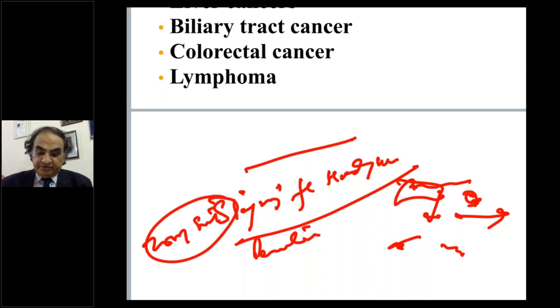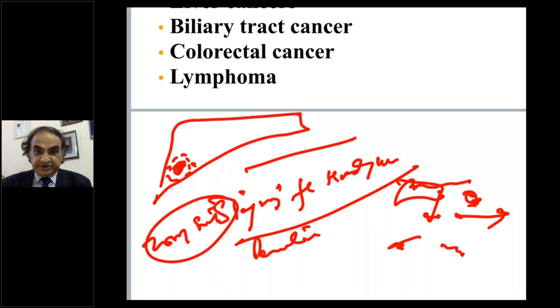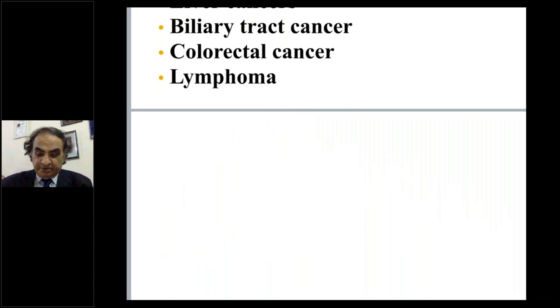In colorectal cancer, take care of where the metastasis is, record it, use cold scissors, remove it, fulgurate it later. Don't just use diathermy. The other place which I didn't mention was in pancreatitis, where people put in a scope to do necrosectomy or to put in a drain there, and sometimes to just rule out bowel ischemia. There are other non-invasive methods, so I therefore did not highlight it. You can take that in question answer.